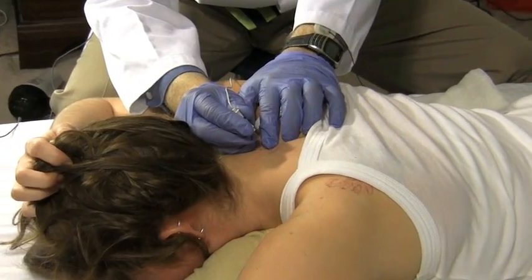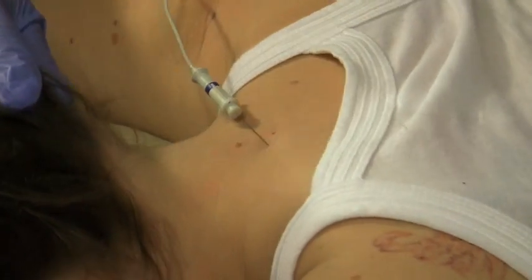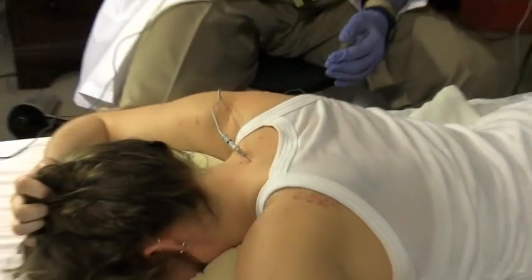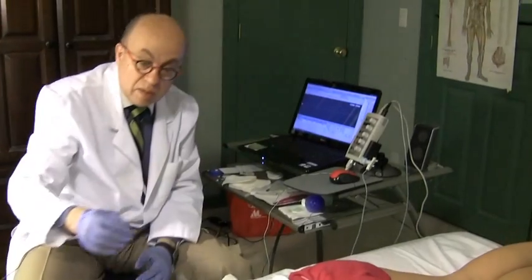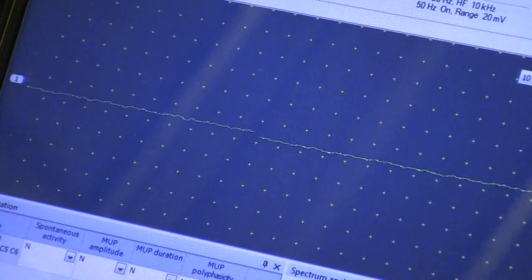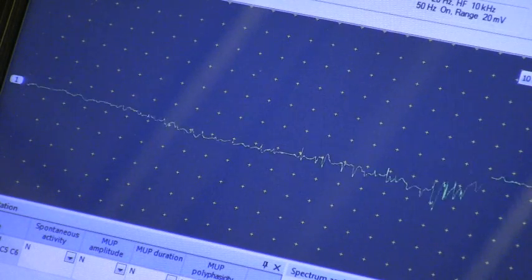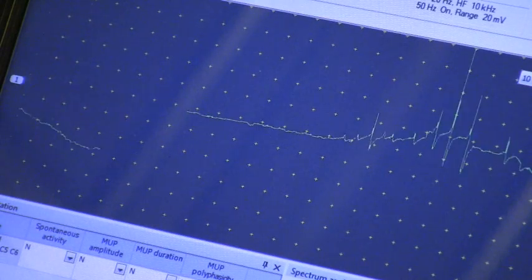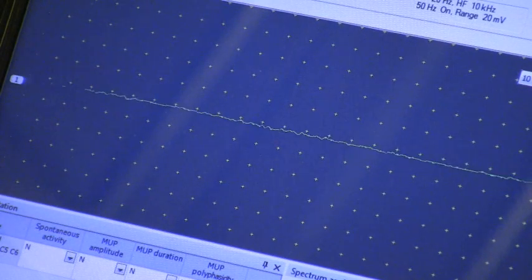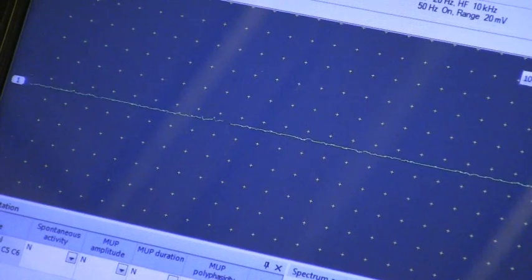It's going to be a needle stick here. Here we go. Now relax, put your head over the pillow. She's very nice and fully relaxed, and I'm in C7. Relax a little bit. Insertion activity is perfectly normal here. I don't need to activate it.